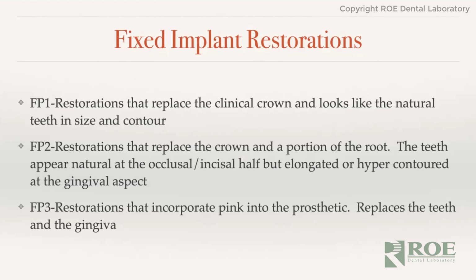Joe mentioned these, the Chrome Natural, which we're starting to do, and these are an FP1, maybe an FP2 situation. I love these because I think there's a great place. We don't always have to be removing a lot of bone. We can just recontour the bone around where the implants are placed, place the implants, and get a very natural FP1 restoration. The importance of this is that Chrome Natural is going to be a little bit more expensive and the parts are going to be different. So we need to know how to charge that in.